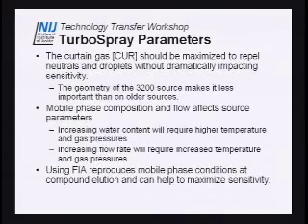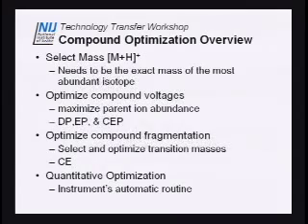The instrument method that we've created is one for 130 drugs that come off from the very first minute to about 18 minutes. So we just generalized for everything. Okay, so now you have a beautifully optimized source that's both general and optimized. I mean, that thing is producing ions. So the next thing you need to do is start infusing your drugs and picking your compound parameters to put in your MRM transition method.